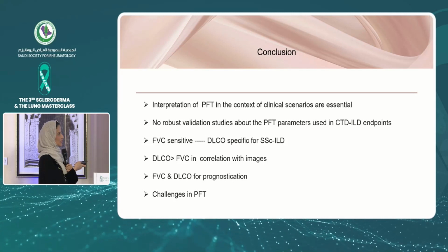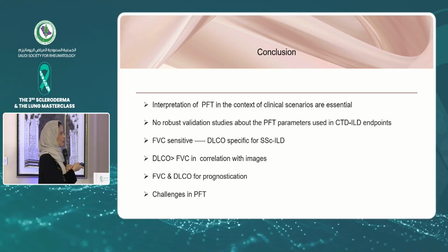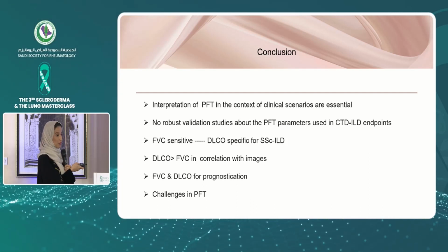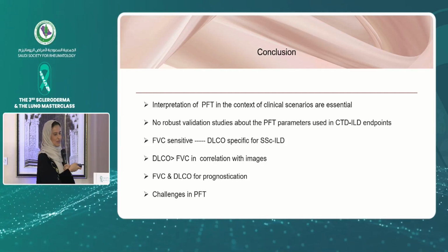So interpreting PFT should be done in the clinical scenario. There are no robust validation studies about the PFT parameters in CTD-ILD endpoints. FVC is sensitive, DLCO is specific.